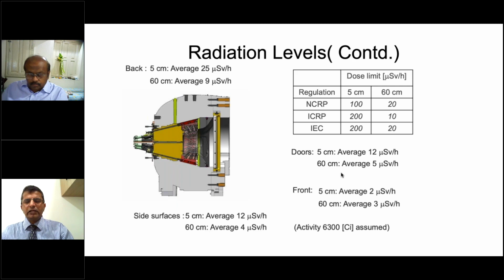So if there are some centers which have a door between the control console and the radiation unit, in some countries' regulations it permits that there is a glass window, not a door, sorry, between the control console of the gamma knife unit and the radiation unit because of the lower scattering and lower leakage from the radiation unit. This is very much possible.